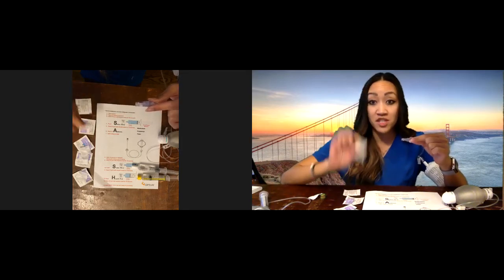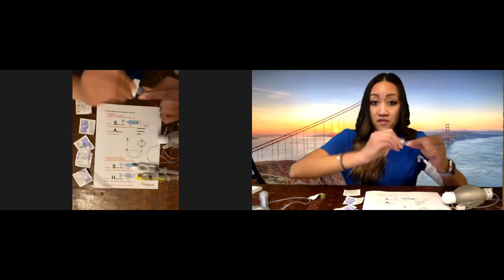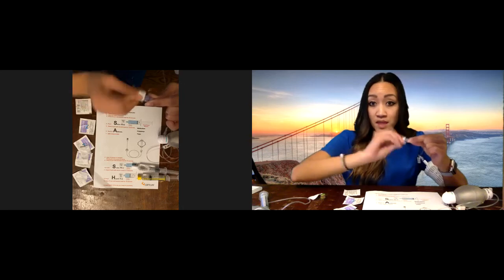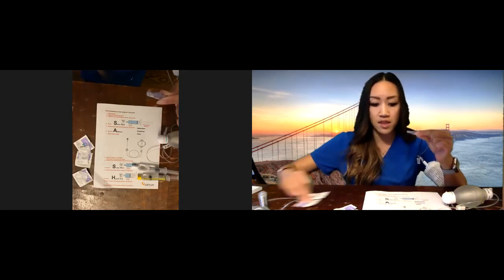Grab a new swab and clean in between for 15 seconds. We always grab a new one because everything that you use, you only use once. Everything is a one-time use and you dispose of it.